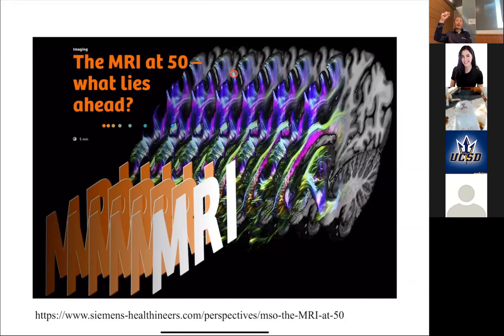if a part of the brain or body is here, and I've excited the magnetization here, and then it moves to some other place, and then I excite it at some other time, then I've sort of screwed up all the timings, right? So when things move too much, even the equations become more difficult. But that's actually where people are finding that deep learning works incredibly well, better than you'd expect, because it can see through all that and say, okay, even with all these artifacts, I know what an image should look like based on my training.